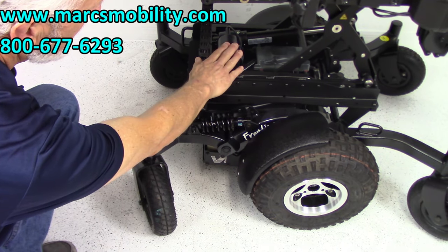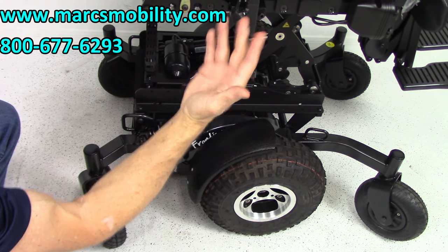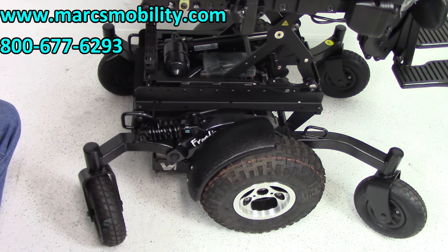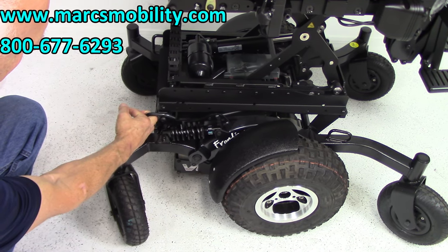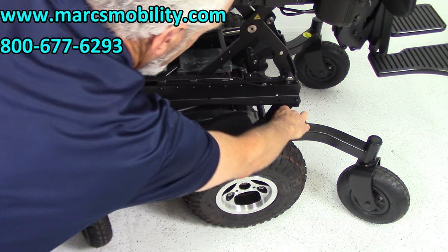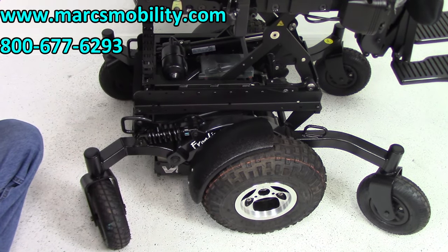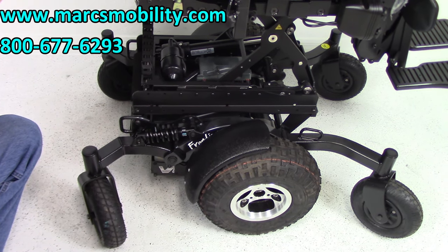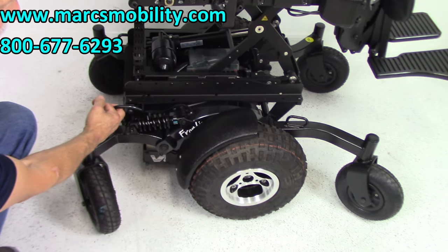You can see the motor here for the seat lift — this chair is super clean, practically brand new. You have anchor points here to tie your chair to your lift or van, one in the back and another up front, two on each side, to secure the chair when you need to transport it.